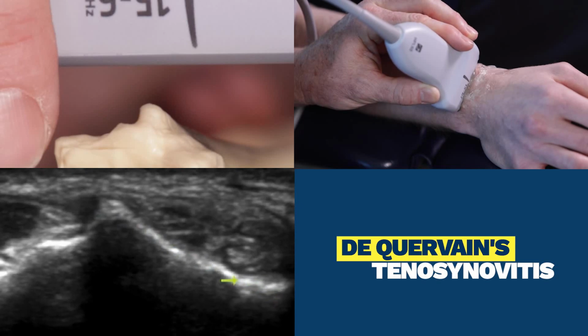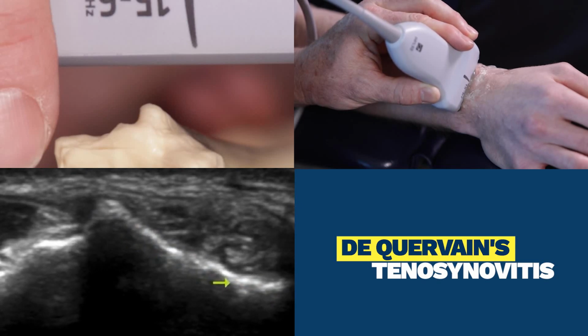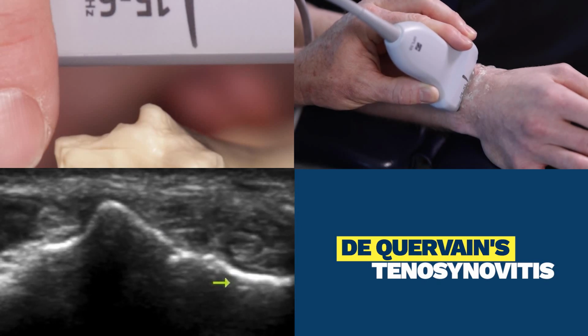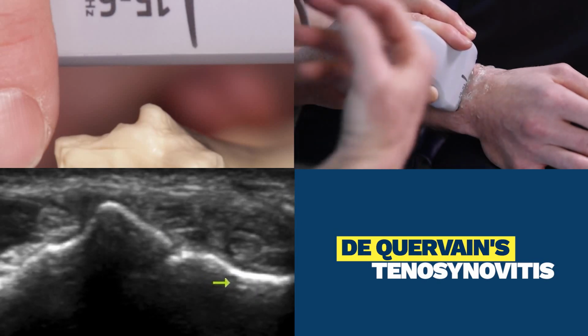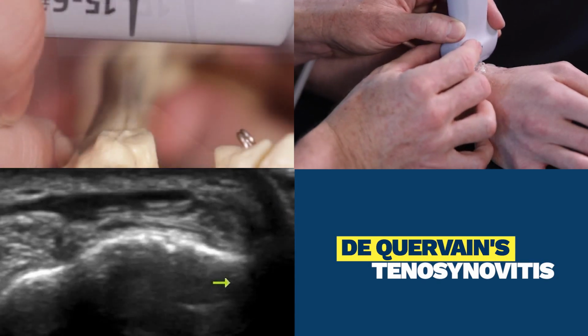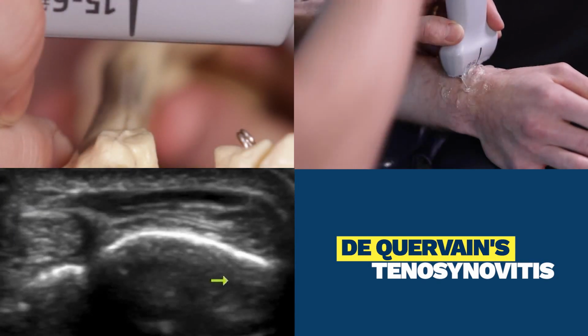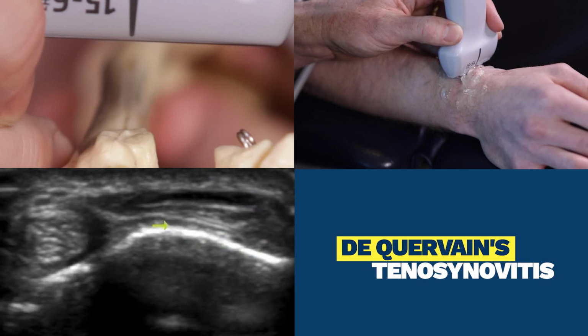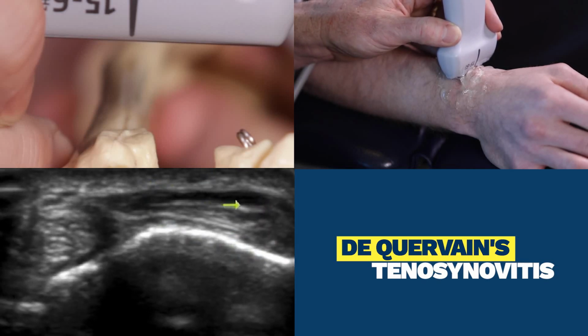And this whole length is the second extensor compartment. De Quervain's is the first extensor compartment, so we'll come around the corner and we're now on the first extensor compartment, with the two tendons of the first extensor compartment being highlighted by the yellow arrow.